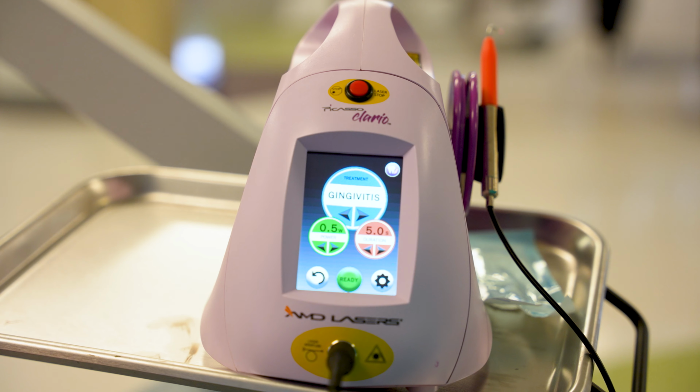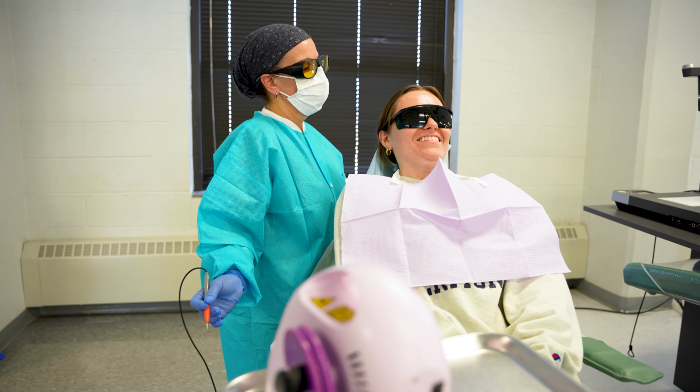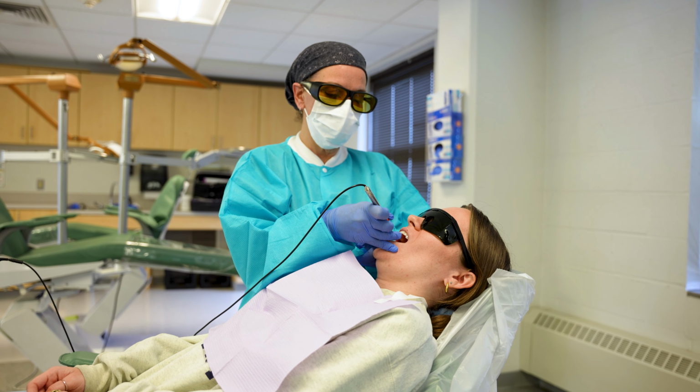The laser is a treatment device. We utilize it for many different reasons. We can eliminate or arrest certain lesions at different phases. It can desensitize patients in a number of fashions. Cold, hot sensitivity is something that patients suffer from quite a bit, so it can desensitize the patient.